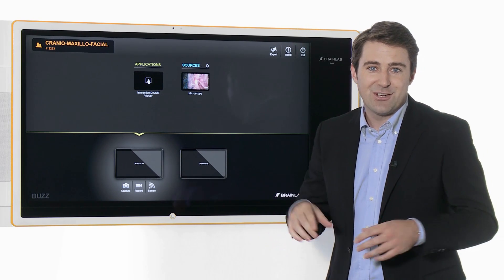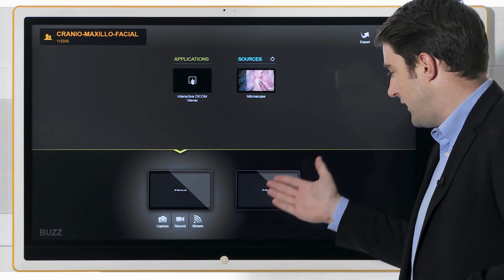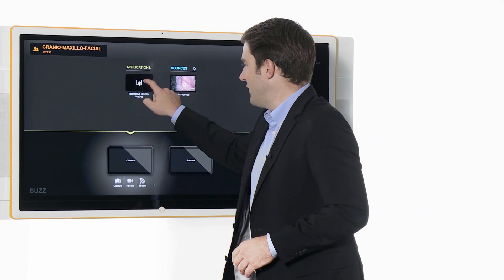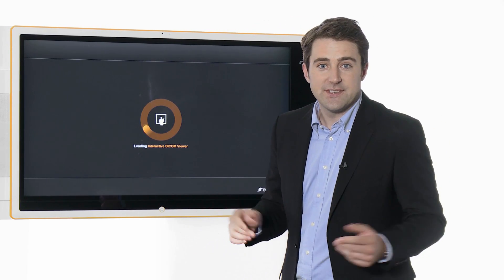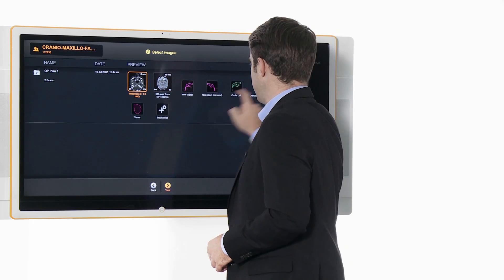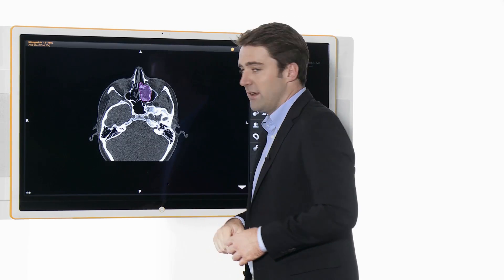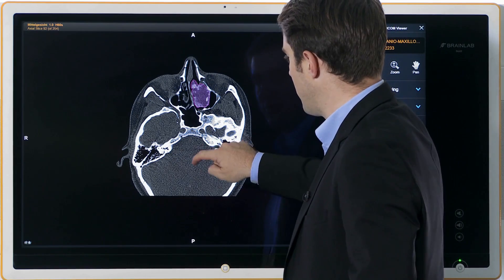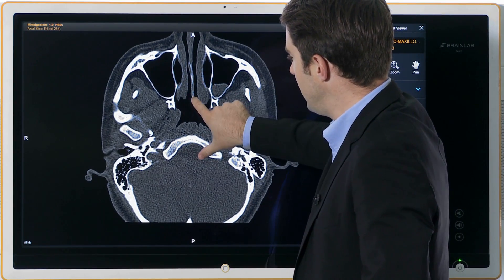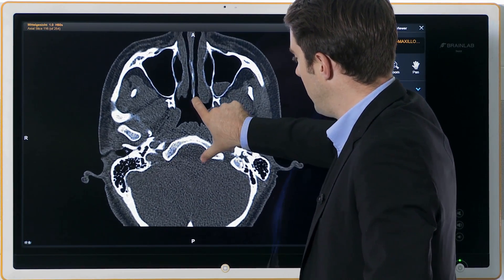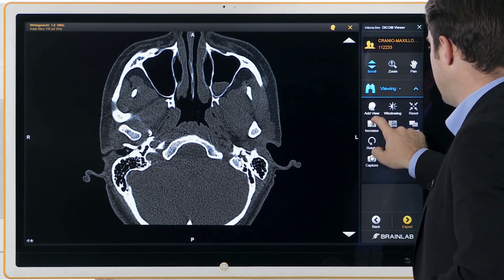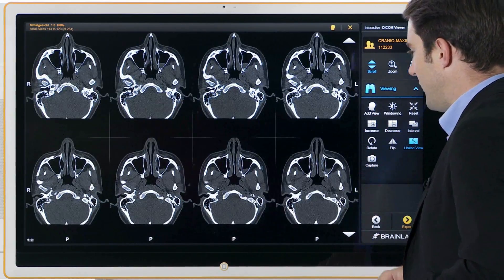In this Buzz configuration, an external display is also connected. To review images, I select the DICOM viewing application and choose a CT dataset. Intuitive gestures such as scrolling, zooming and panning allow for the quick location of information, and adding additional slice levels is simple.